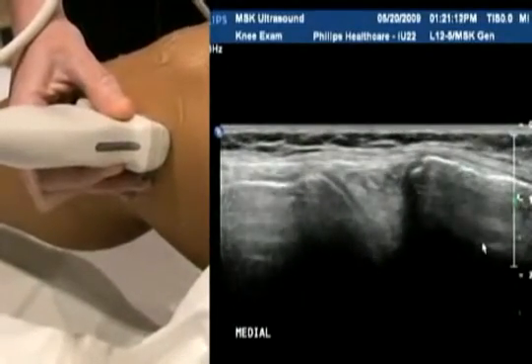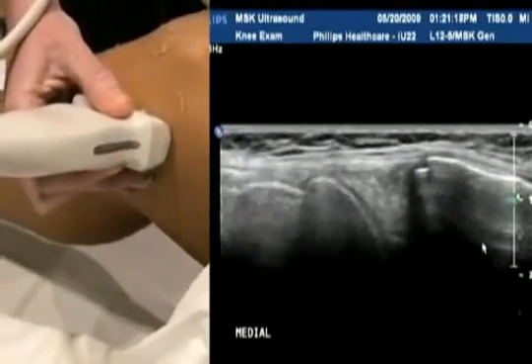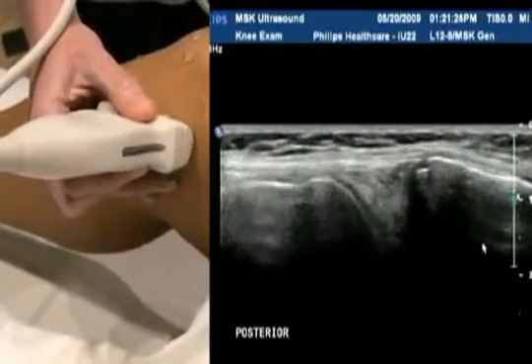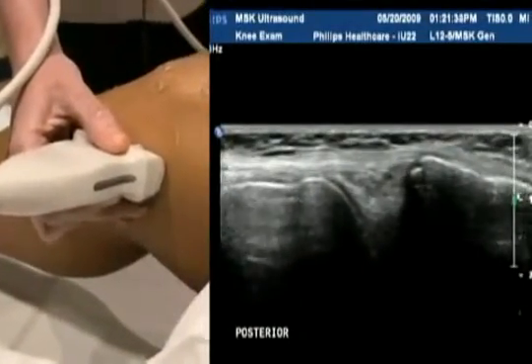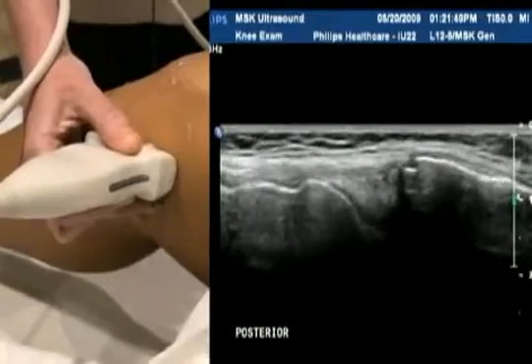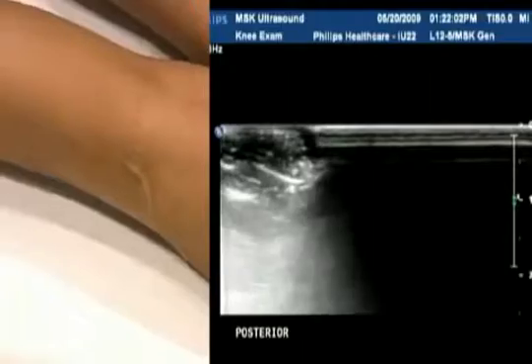Those are the major components we look for in the knee anteriorly. The other thing we can do, depending on the patient's symptoms and indications, is to look posteriorly in the knee. Most people, when they talk about musculoskeletal ultrasound, one of the first things that comes to mind is a Baker's cyst, and certainly that's something we're going to find posteriorly in the knee in the popliteal fossa. If the patient is difficult to move around, it's perfectly fine to approach from the side, but you're going to get a better overview if you can get the patient prone.